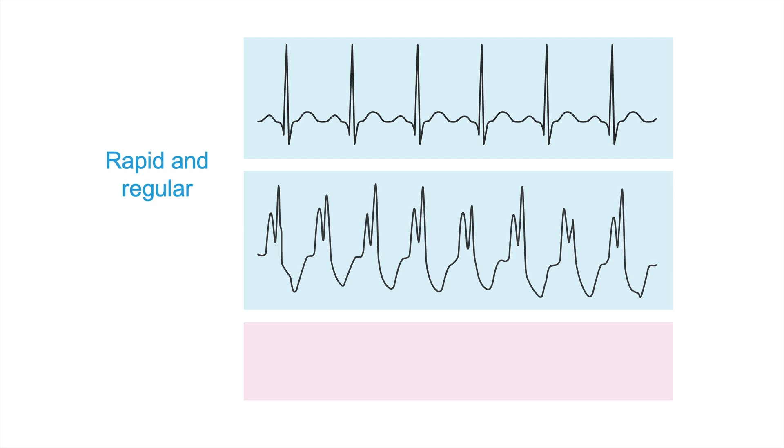What do I mean by regular? Well, regular means that the distance between the QRS complexes is constant. This distance is the same as this one, as this one, as this one, and so forth. And the same holds true for the tachycardia below.